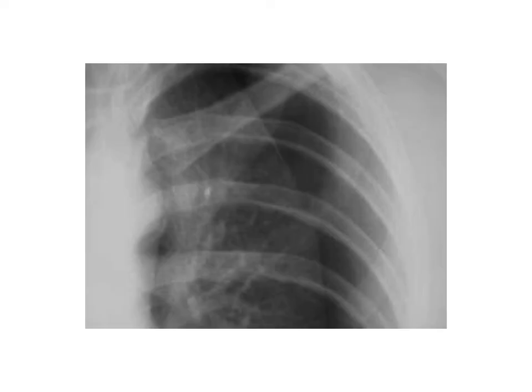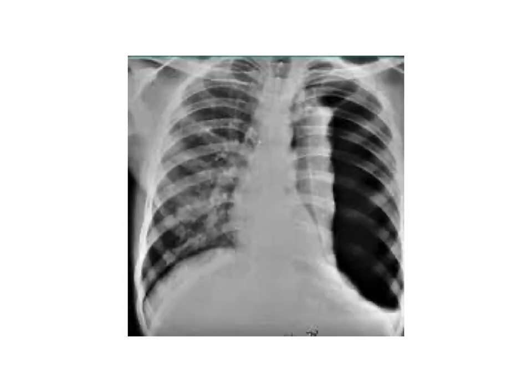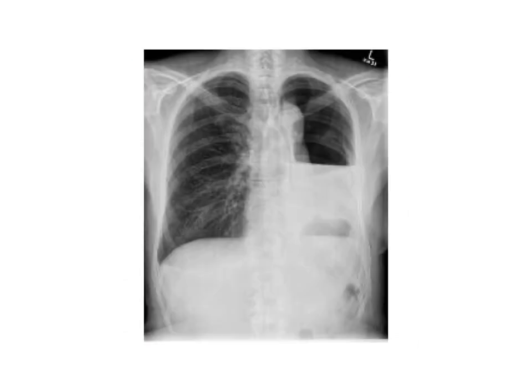So like I said, this is a sample of pneumothorax. This is the lung here. This is the air in the pleural space. You can see it here very, very clearly. And it's also another sample of pneumothorax. On the left, pneumothorax. See there is displacement or shift of the mediastinum to the right side. It's very clear in the pneumothorax. This is another sample of pneumothorax, and this is a sample of hydropneumothorax. You see this clear area here, and with this an air-fluid level. So we are in the presence of hydropneumothorax.